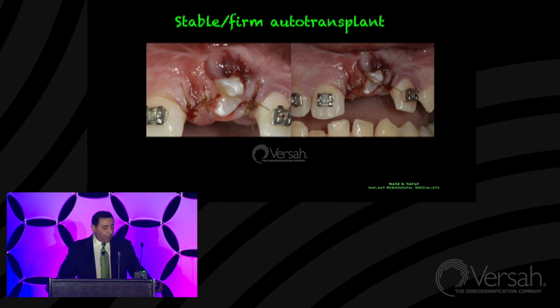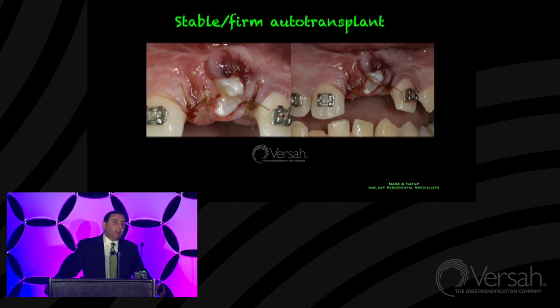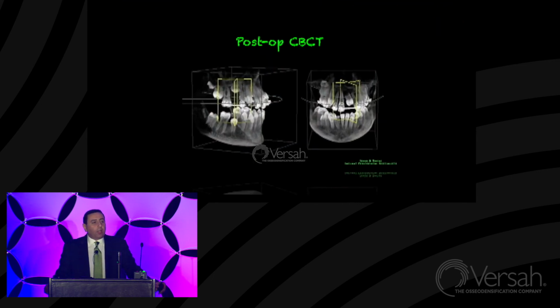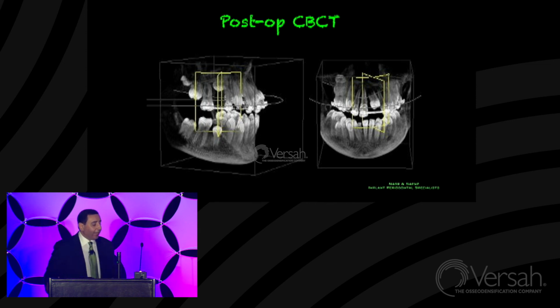Since I haven't had the chance to see Caleb for a few weeks after that, I told him, let me take a CT scan so we can compare things when you come back to visit New Orleans and your father during the holidays. So we took a CT scan to make sure that we have everything in position and the tooth is there. I had my front desk call his mom every couple of weeks or so, make sure that that tooth is not being loaded or traumatized and make sure that it's functioning well. And said he's very happy. He's just besides himself that he has a permanent natural tooth. And he just looks like some of the other kids who are having braces in his class now.